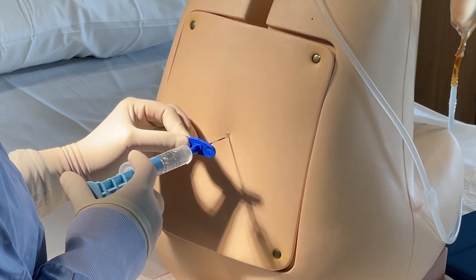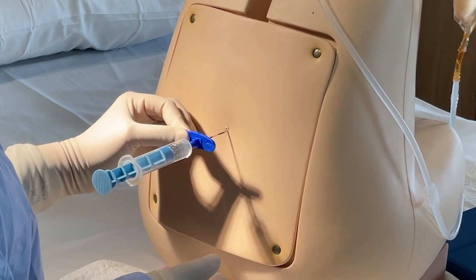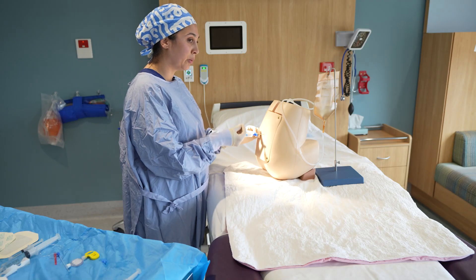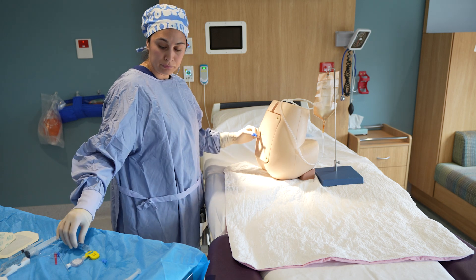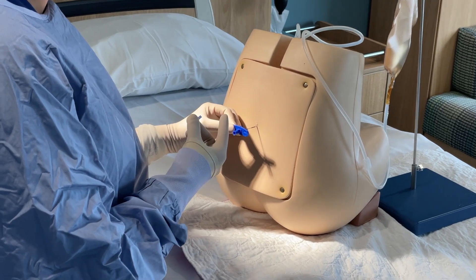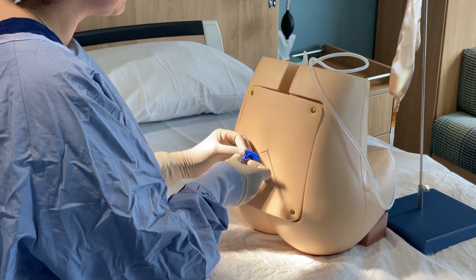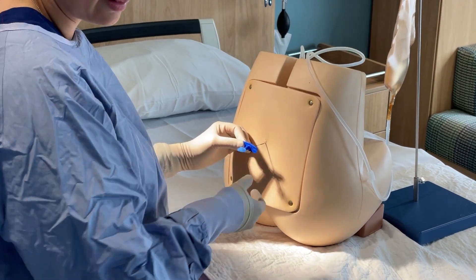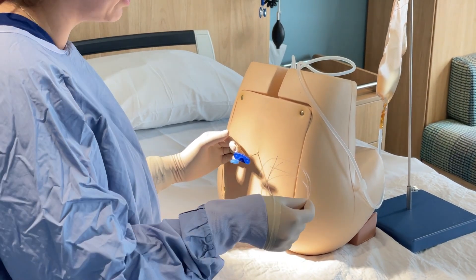Apply slow and continuous pressure on the plunger until you get a very clear loss of resistance. You often get a firmness before that loss of resistance. Note where your needle is at this point — it's often helpful to say it out loud. In this patient, we're around four and a half centimeters.